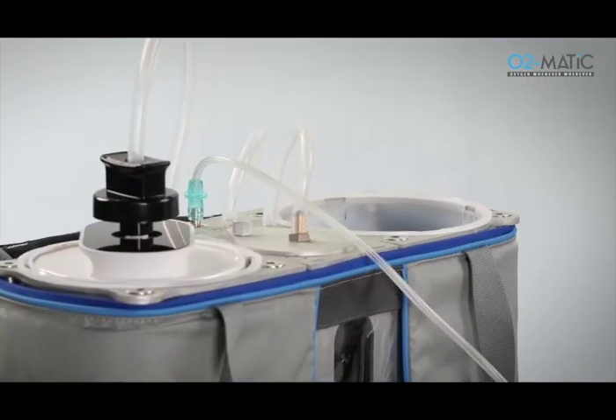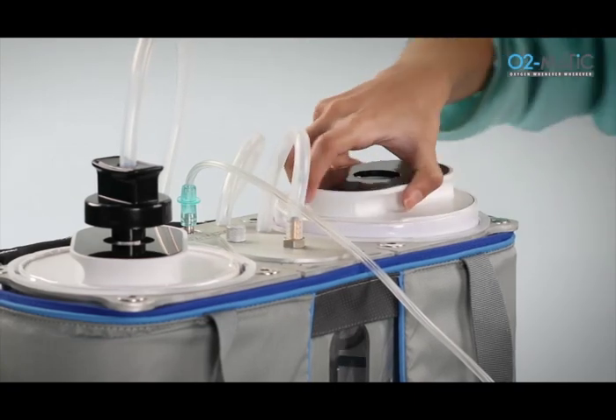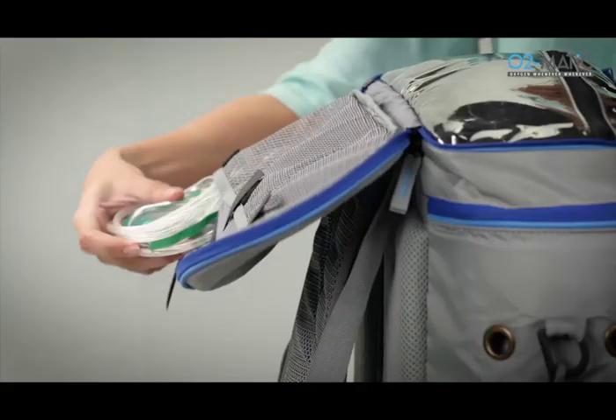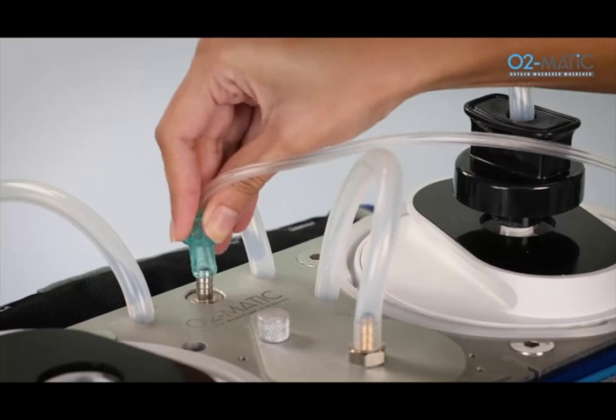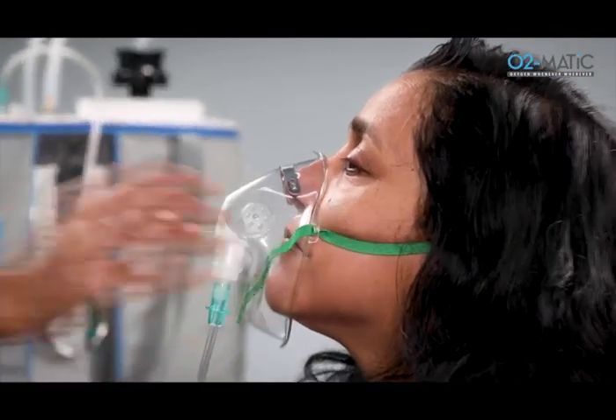Cartridge slots are provided where the cartridge can be conveniently lowered and locked into place. The oxygen mask is attached to the oxygen outlet port and the mask is placed over the patient's nose and mouth.